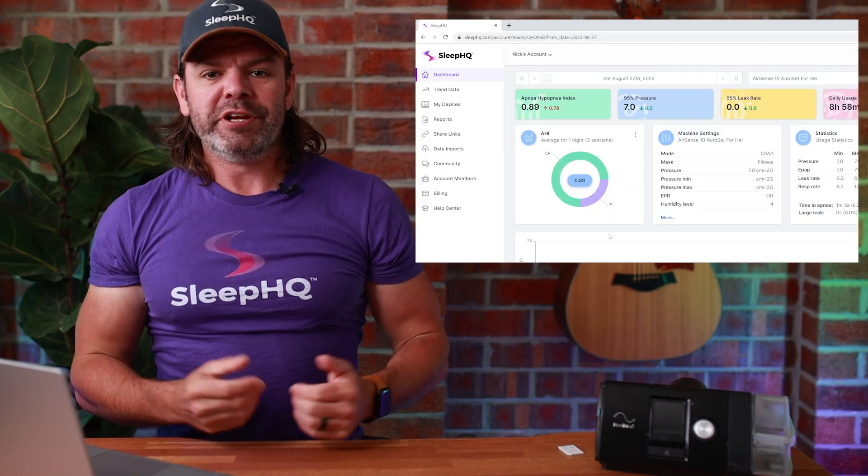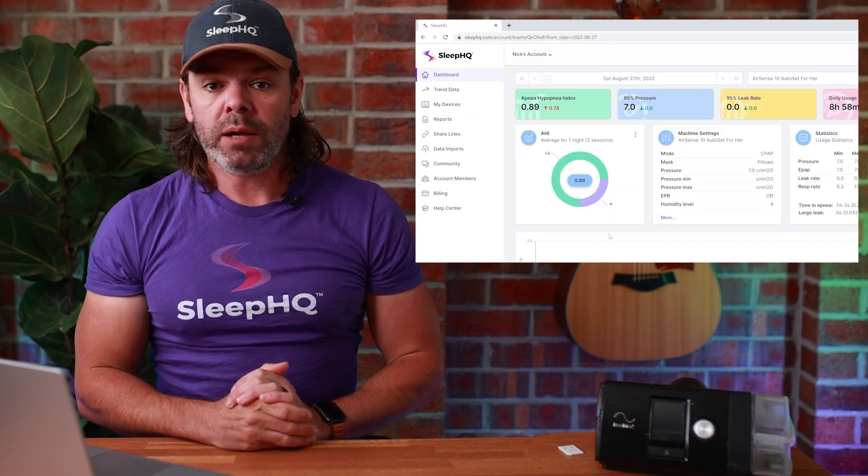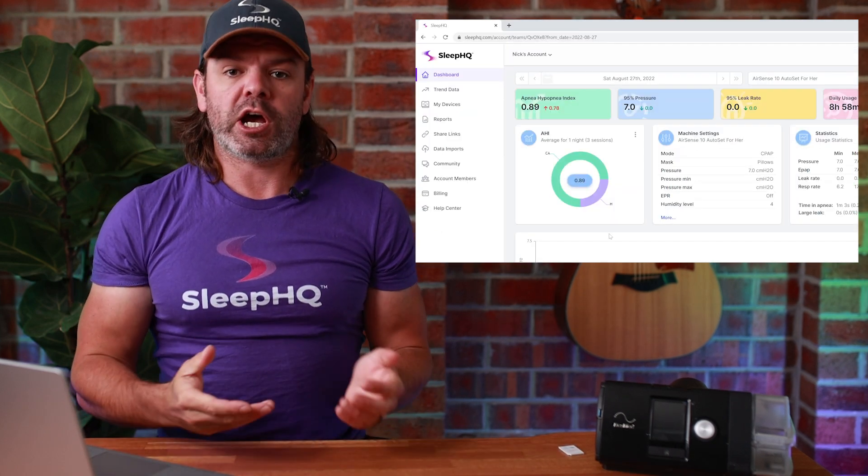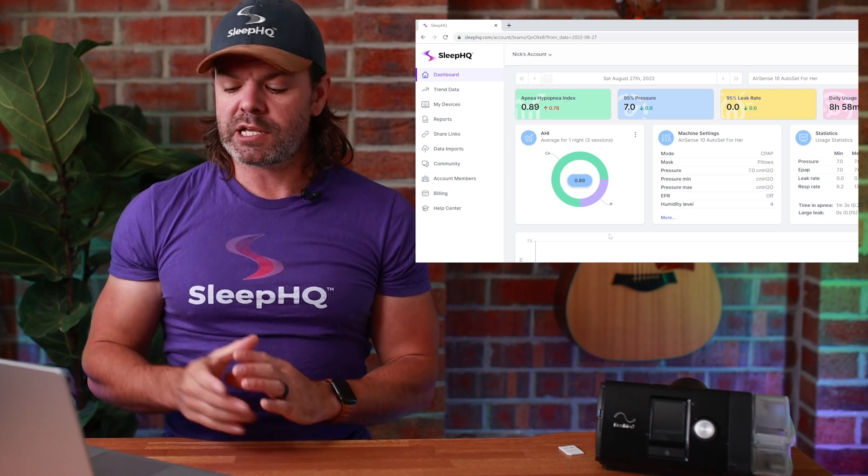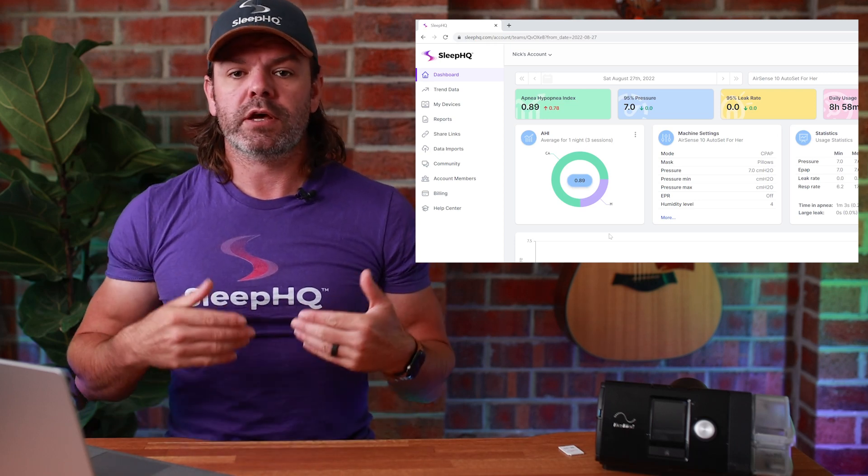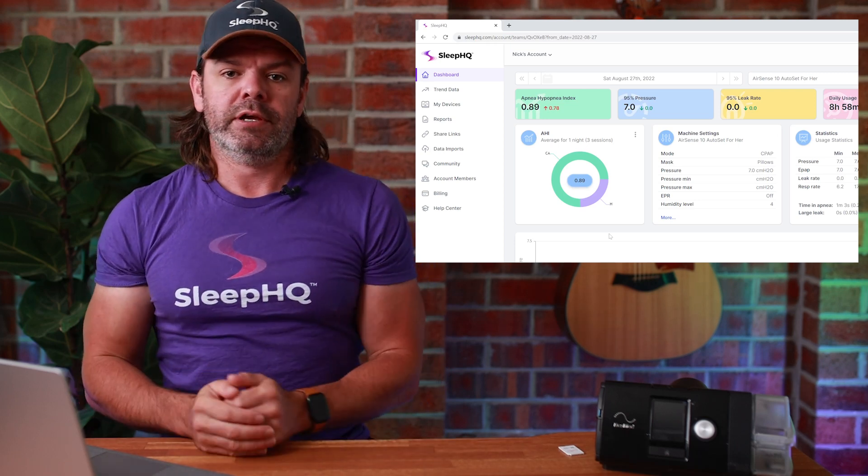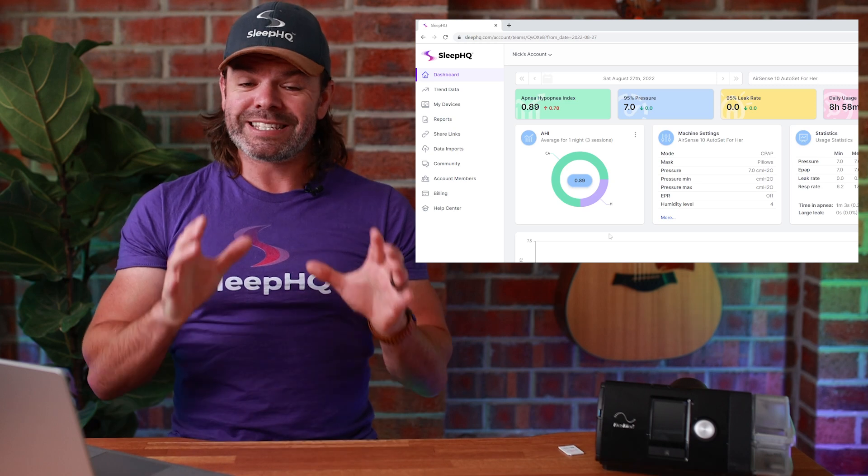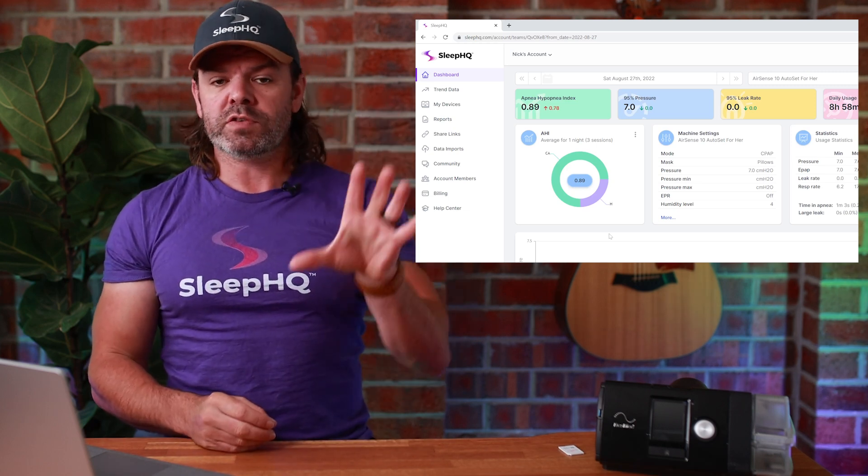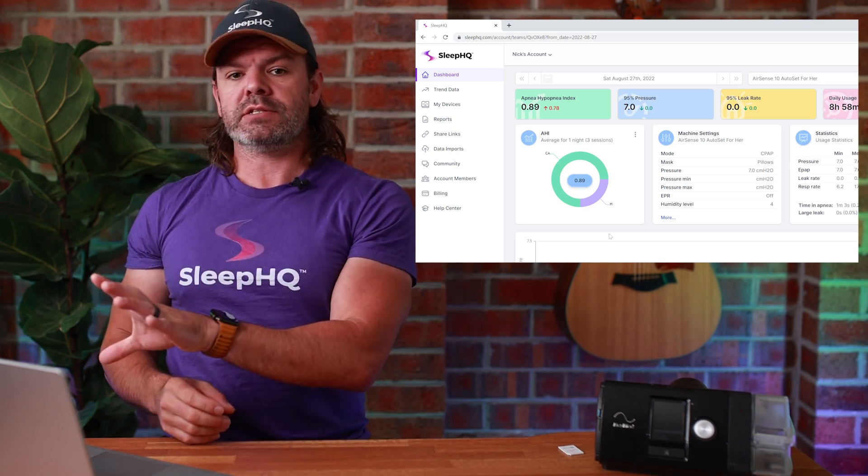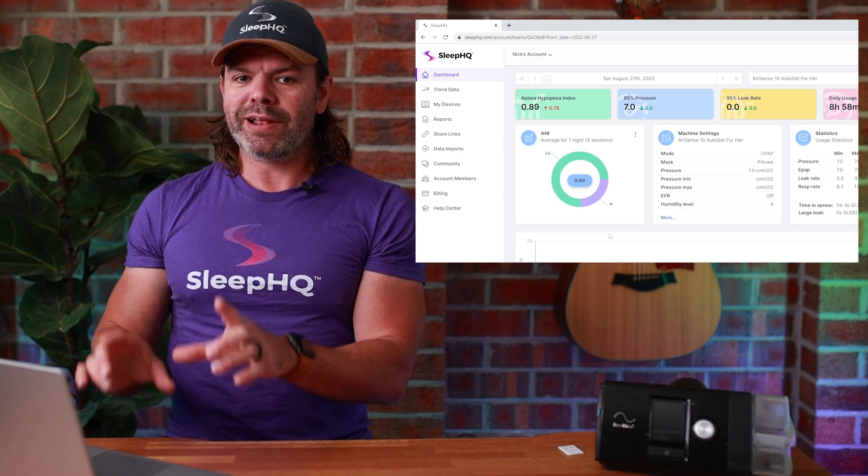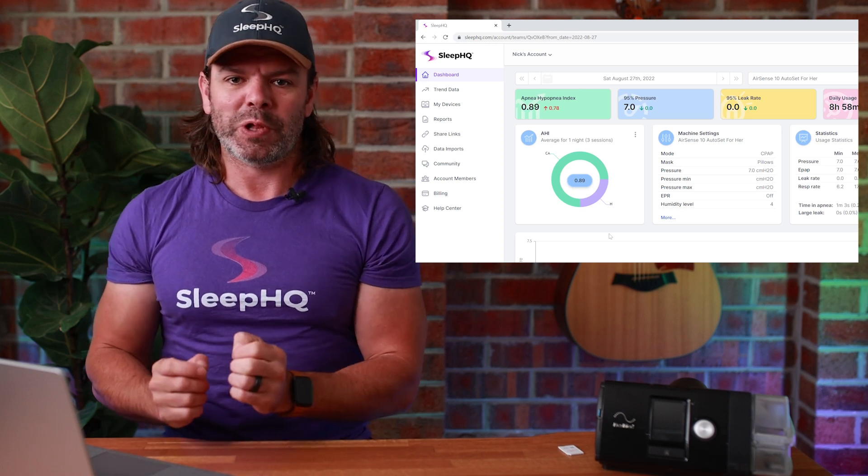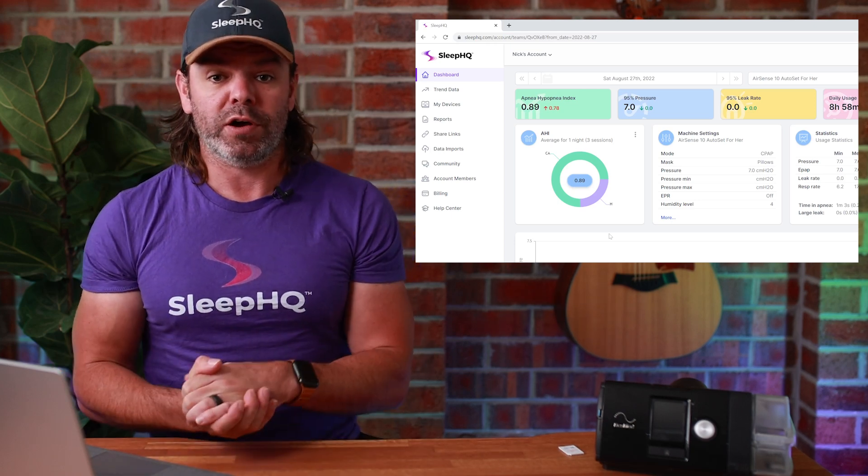Although your initial upload might take a little bit of time, future uploads will be much faster as SleepHQ will only process the new files added. So just do the exact same steps, drag all the files and folders from your SD card into SleepHQ. Don't worry about it. SleepHQ will only process the new files.